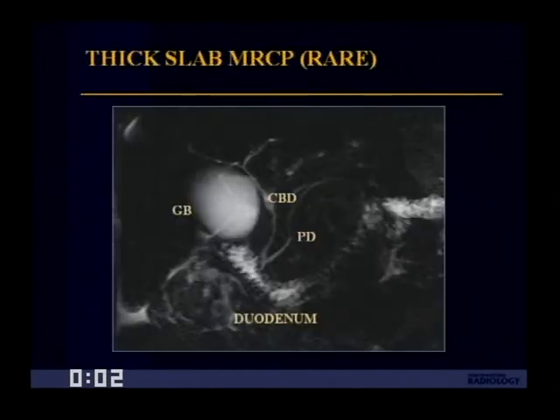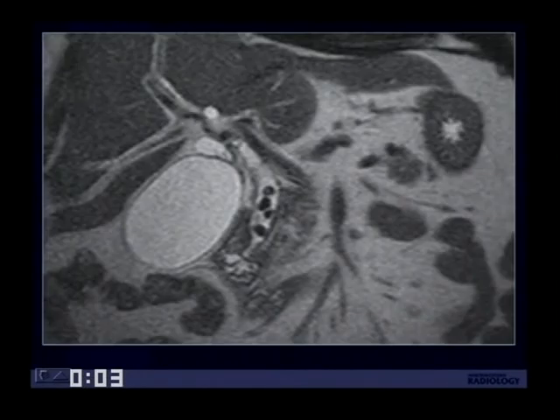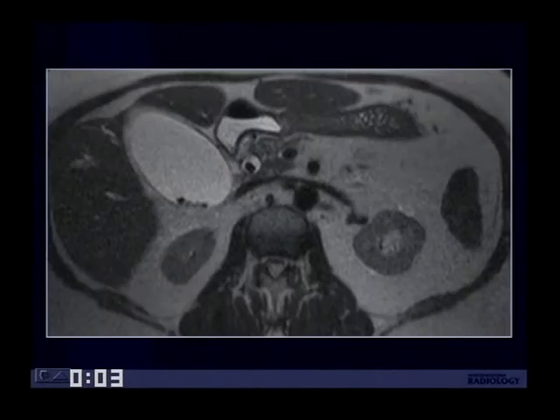The techniques we use include thick slab MRCP, or RARE technique, as well as thin-slice T2, or HASTE (single-shot fast spin echo). Here's an example of a thick slab MRCP where you can see the normal common bile duct, normal pancreatic duct, and some effacement of the duodenum due to pancreatitis, with no evidence of stones or duct dilatation. Here's a patient who demonstrates multiple small stones within the common bile duct on MRCP using the HASTE sequence, confirmed on axial images.